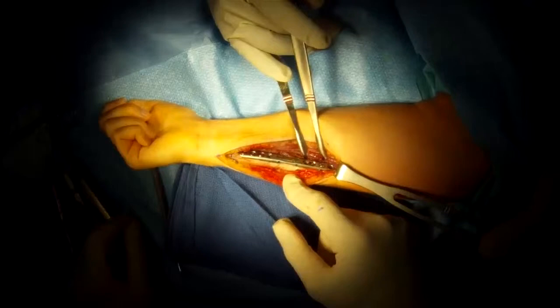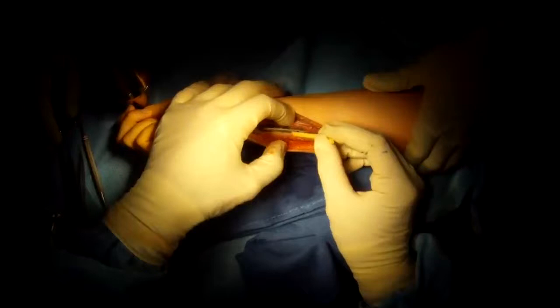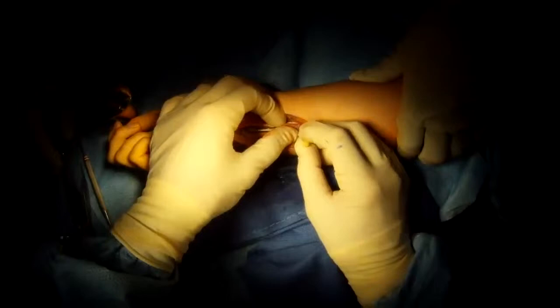It takes a while for this bone to heal. Many times you can see the plate on the bone — the bone is very well opposed and has been shortened. Now we place synthetic bone graft to speed up healing. All done.